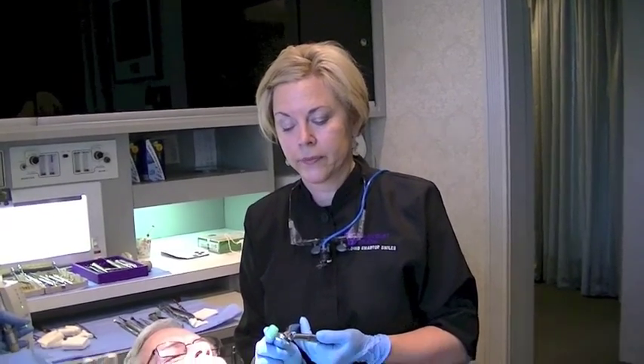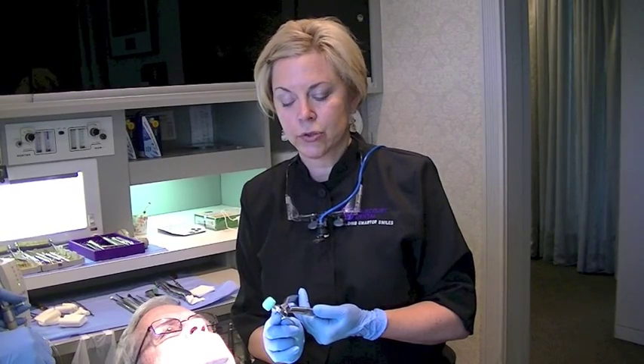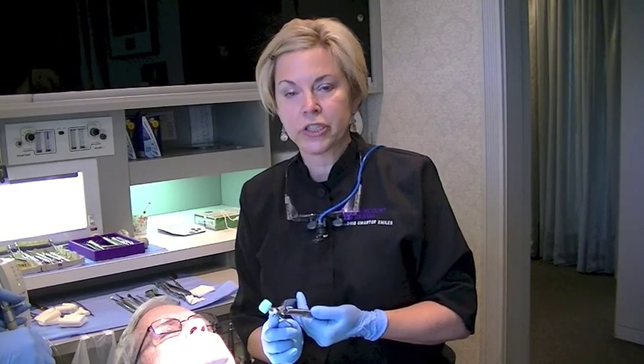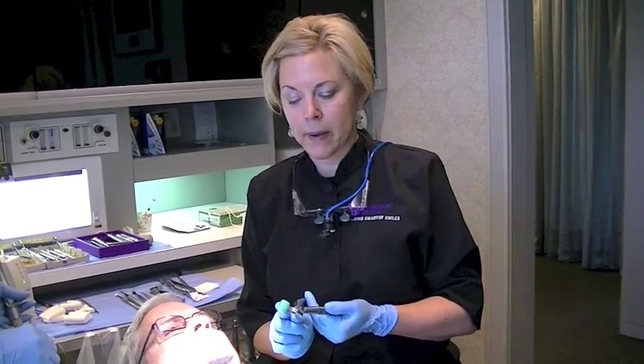Our patient has tooth number 14 that we're going to be extracting. Here's the physics forcep and you can see there are two basic parts: there's a beak and there's a bumper. Our goal will be to place the beak about two to three millimeters subgingival to the crown on the palate, and then place our bumper as far as we can into the vestibule.